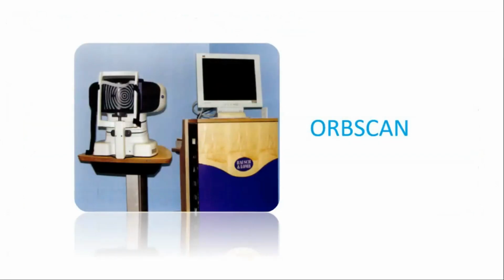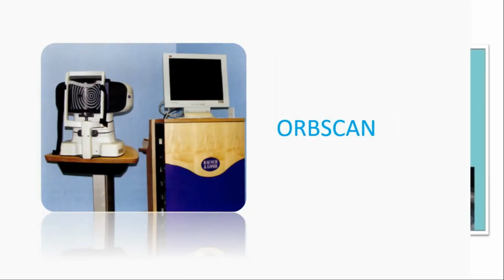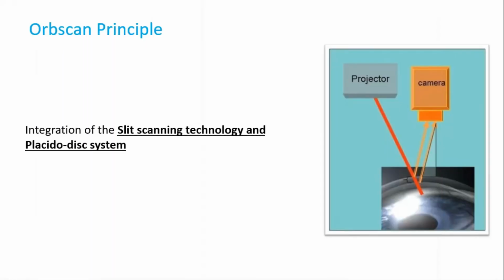Orbscan works on the projection principle and measures the surface elevation by slit scanning triangulation technique, and it also uses Placido disc reflection technology along with the slit scanning technology.